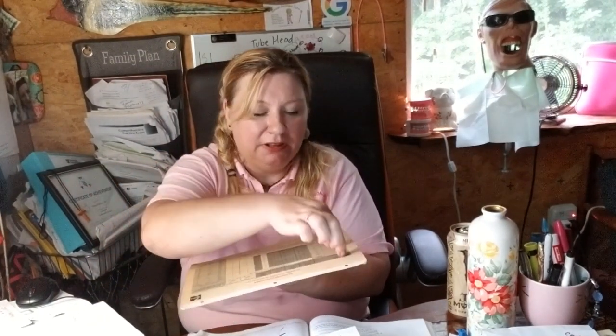Really, x-rays aren't too hard. If you don't want to do the memorization of the degrees, you've got the ring kits to fall back on. Look like you know what you're doing. Fake it till you make it. Always remember to lay them out. If you're old school at your office, lay them out on your tray or on a bib or a paper towel, because it's cheaper. You don't want to waste, because when it comes raise time, they're going to be like, well, you used all this for this. But lay them out just like an FMX, okay?